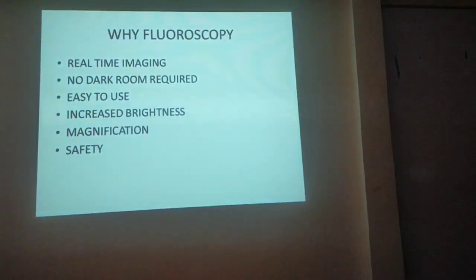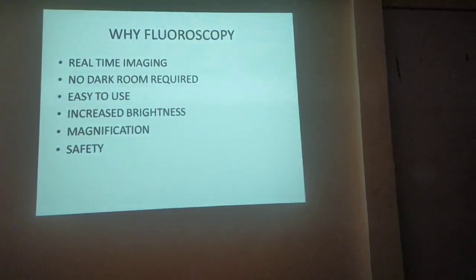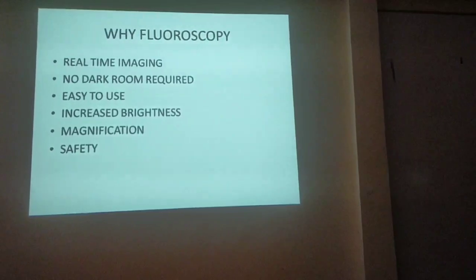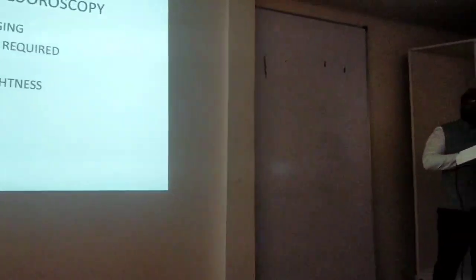Why do we need fluoroscopy? Because, as sir said, it is real time. You don't have to send the patient to the X-ray department to get an X-ray done. There's no dark room required like for a normal X-ray. It is fairly easy to use. You can magnify the image, you can increase the brightness, and it is safe to use.